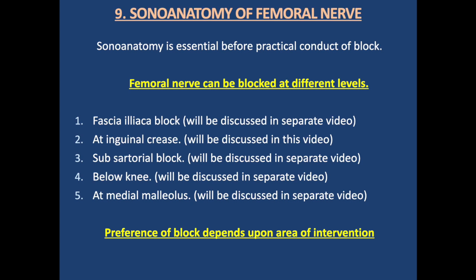Sonoanatomy of the femoral block. Sonoanatomy is essential before practical conduct of the block, and this should be a routine practice in every block to assess the block. There is a high variation in normal anatomy of the nerve in every block. The femoral nerve can be blocked at different levels and it needs different sonoanatomy. The first point is fascia iliaca block, which is discussed in a separate video. The second point in which femoral nerve is blocked is at inguinal crease. It will be discussed in this video.